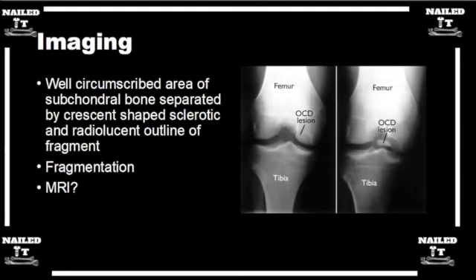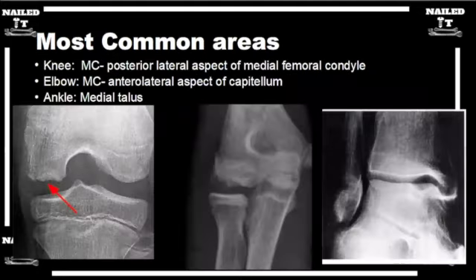In particular, if we're talking about the knee, the standard views that we get for knee x-rays would be a weight-bearing AP, weight-bearing lateral, an infrapatellar, or what people will term the sunrise or Merchant view, and then a weight-bearing PA 30-degree flexed. People often call that the Rosenberg view. Basically, the patient bears weight, flexes their knee 30 degrees, and then it's a PA view.